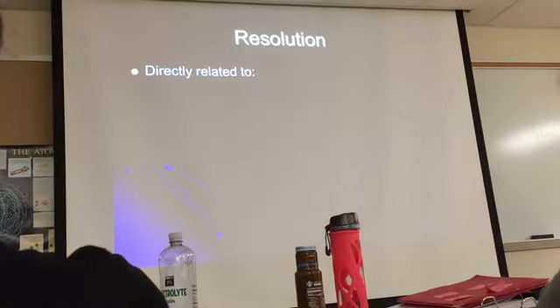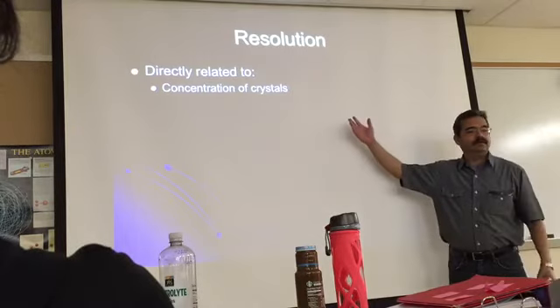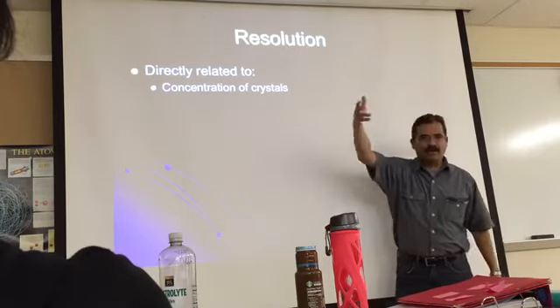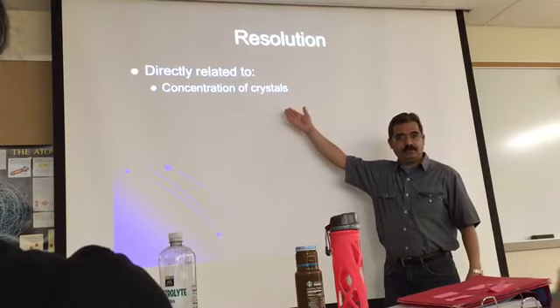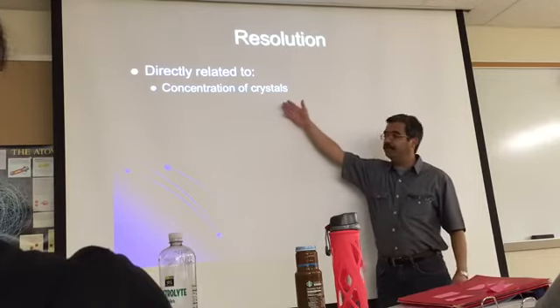Now, directly related, not inversely, to the concentration of crystals: the more phosphor crystals you have, the better the resolution. That's why it's directly related. The more of that, the better you will be.